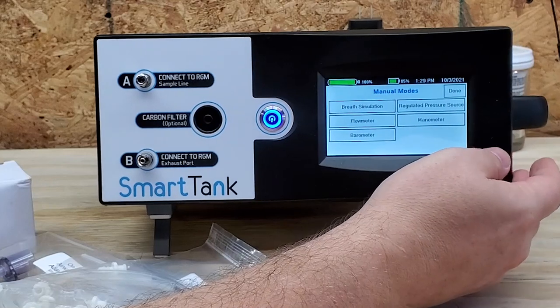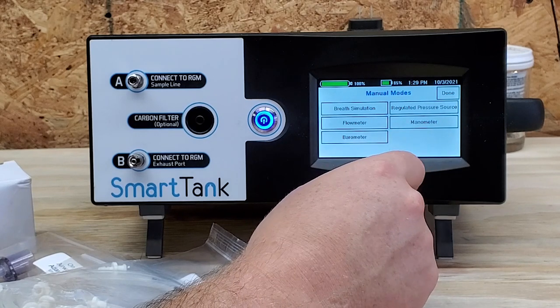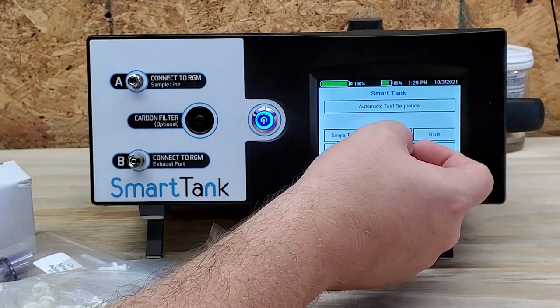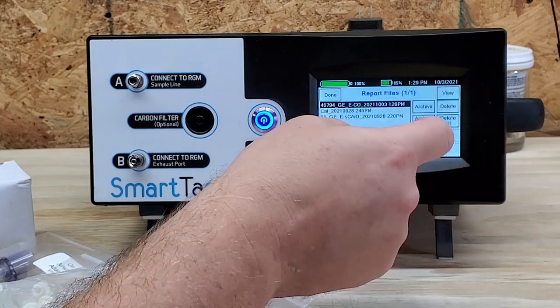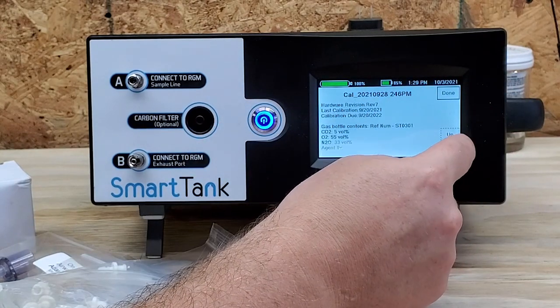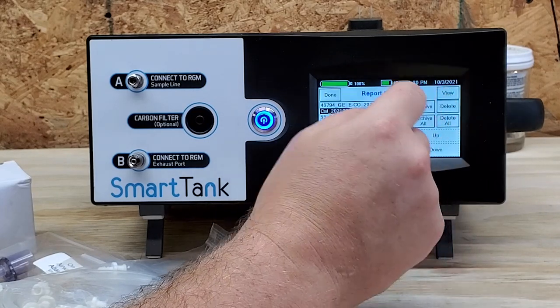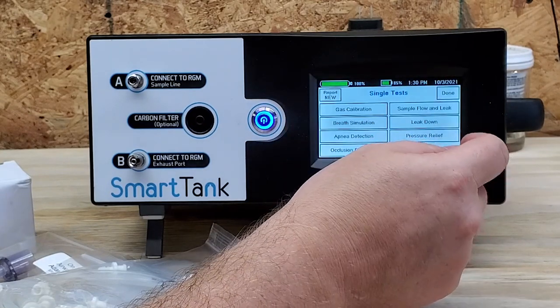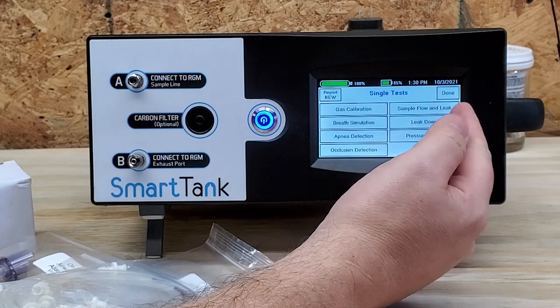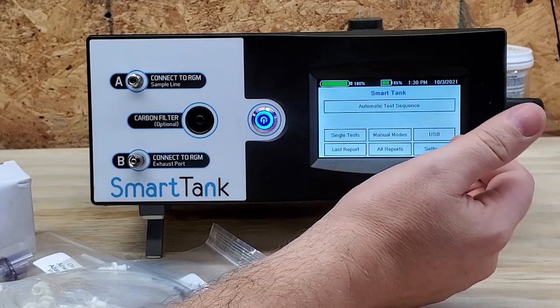In Manual Modes I've got: Breath Simulation, Flow Meter, Barometer, Manometer, and Regulated Pressure Source — very cool. I can also see all reports of other stuff that has been done. In Single Test I've got: Gas Calibration, Breath Simulation, Apnea Detection, Occlusion Detection, Sample Flow and Leak, Leak Down Test, and a Pressure Relief. Very inclusive.